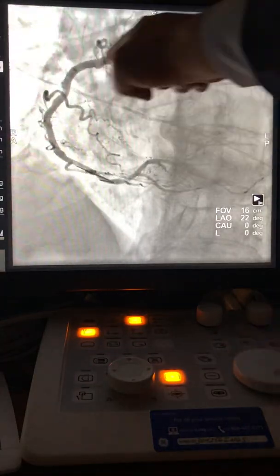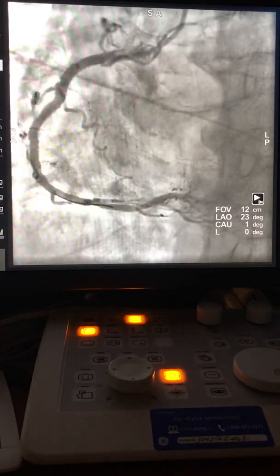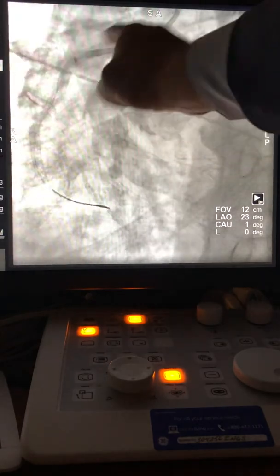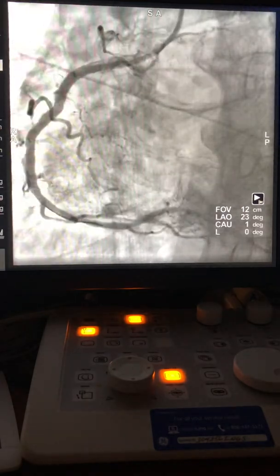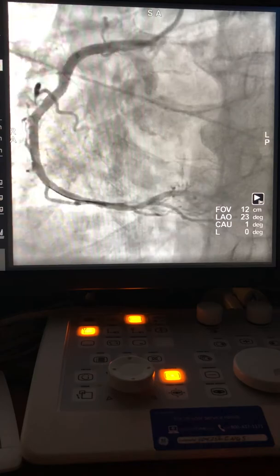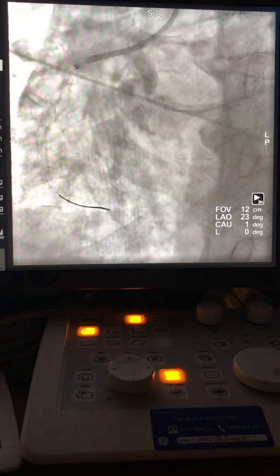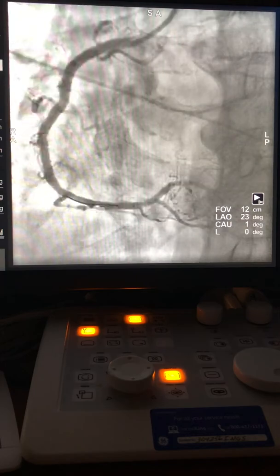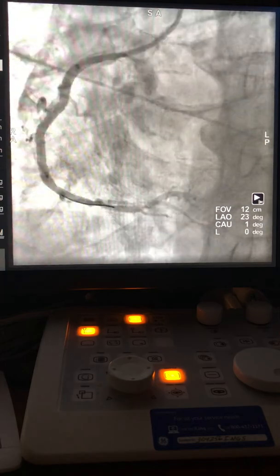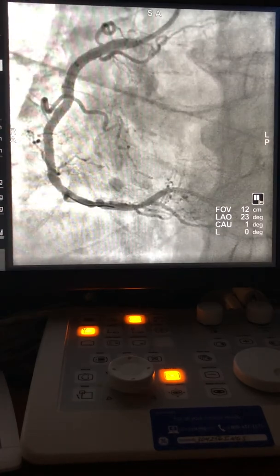This is the final result — different projection, you have nice dye reflux. Of course these cases take longer. Always do post-dilation with a non-compliant balloon. This case took 16 minutes, which is relatively very good timing, with 1200 milligray of fluoroscopy only. Thank you very much — we'll go to different cases at a different time.